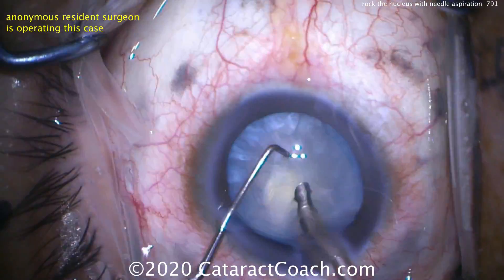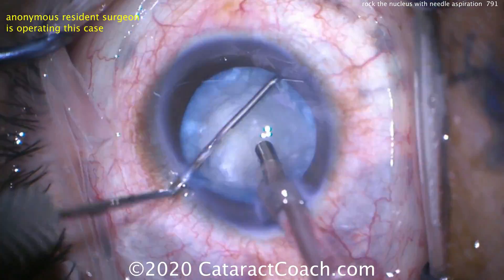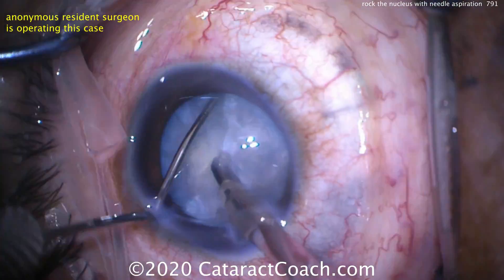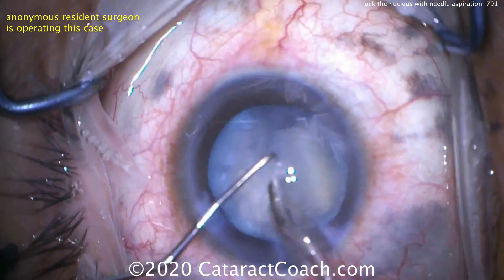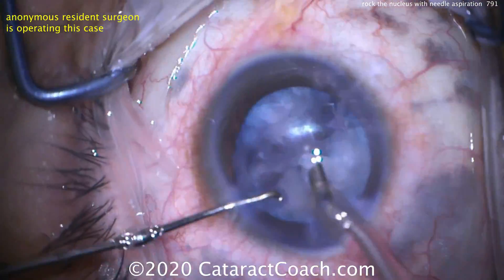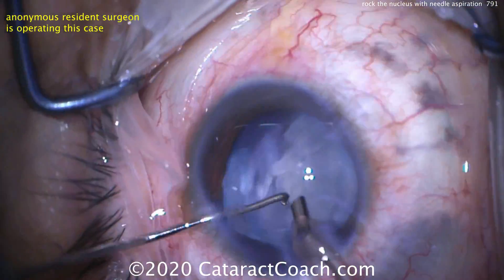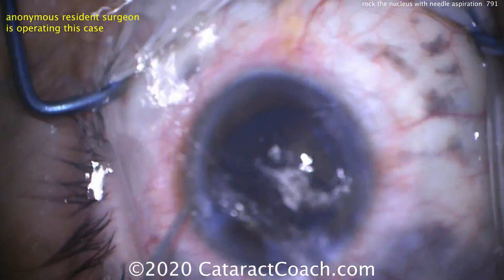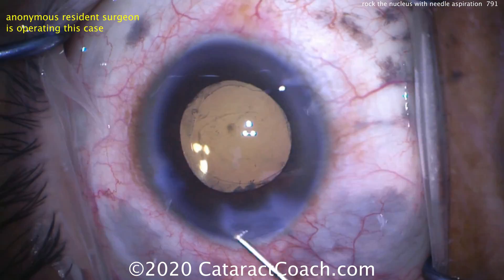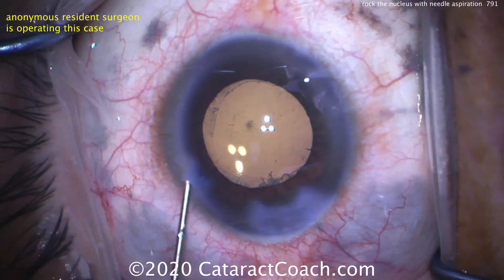Now let's fast forward to the end of the case. The resident will chop the nucleus into many pieces and aspirate it down, and the rest of the case just goes beautifully. This chop technique is very easy to perform in a white cataract because the visualization is great. The blue dye shows you the capsule edge and the nucleus is very white. Here's the end of the case — lens in the capsular bag. That looks great. This patient's going to be really happy.